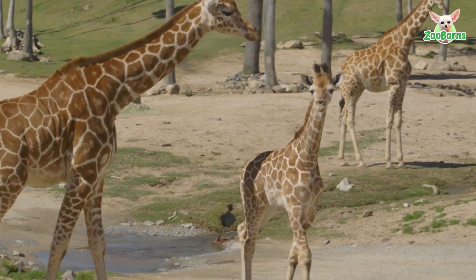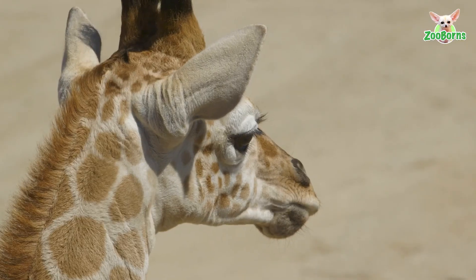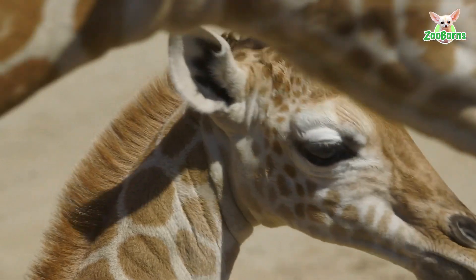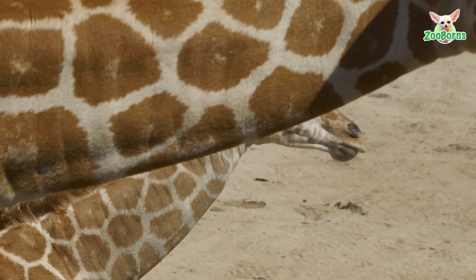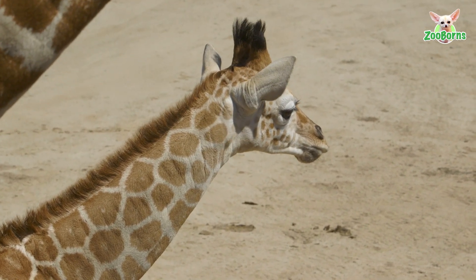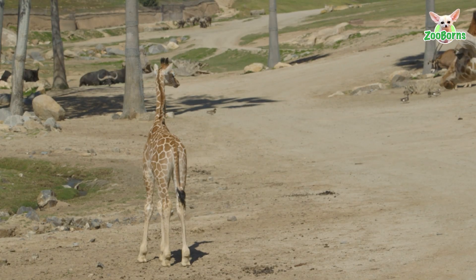We have put braces on animals at San Diego Zoo Wildlife Alliance, certainly. But this is probably the most extensive and most customized brace that I've ever applied on an animal. Occasionally we do have joint concerns or ligament and tendon laxity, but to have it in a long-legged giraffe like this and so severe is unique — and that's what warranted the customization of the brace.